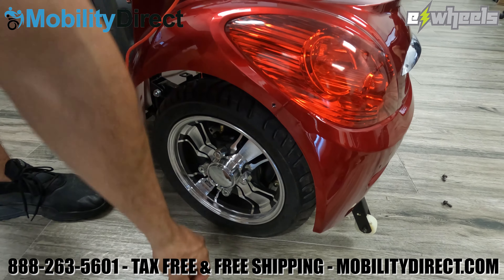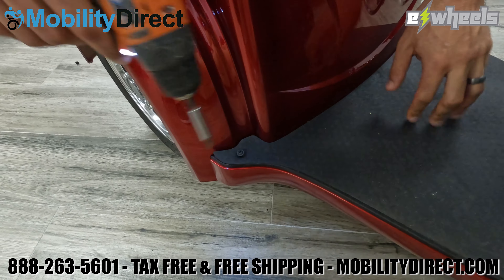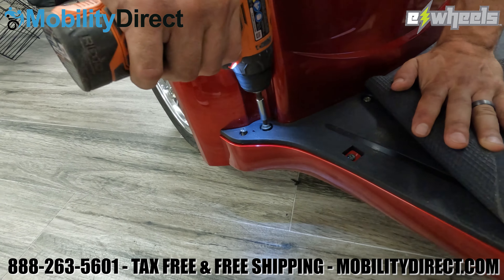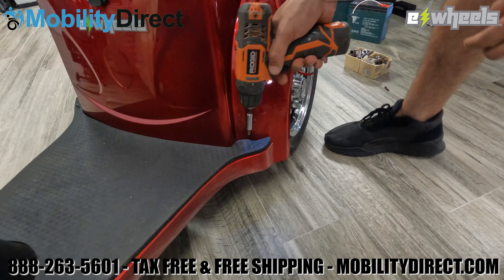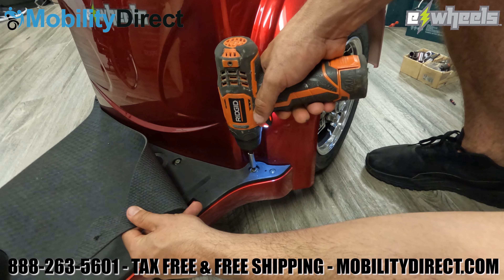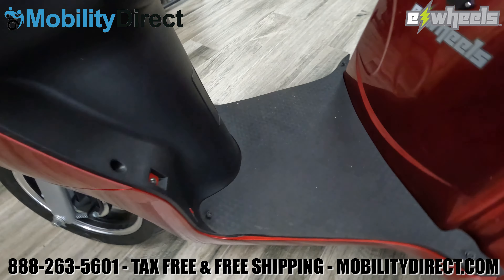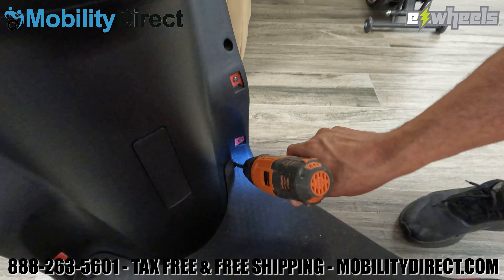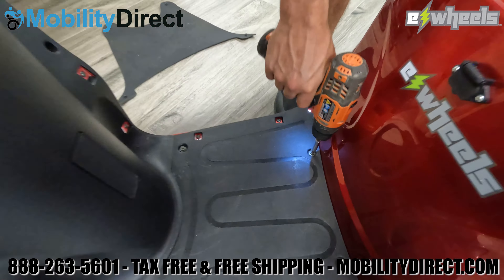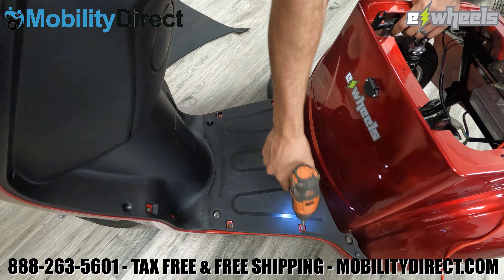Now that all four screws are removed, move toward the floorboard area. First, remove the mat — take out the back two screws holding the mat down on the floorboard, and then remove all of the screws that are underneath that mat. Pay attention to the silver clips. Those silver clips are there so that the screws have something to bite onto; otherwise the threading won't catch onto the plastic paneling. Remove the floor mat entirely and start removing all of the screws on the floorboard one at a time. There are a total of 12 screws on the floorboard, so make sure you take them all out.